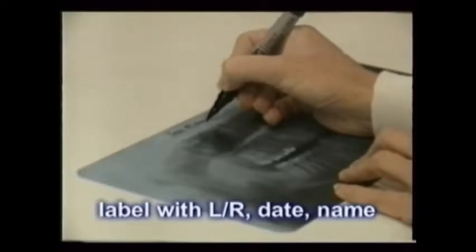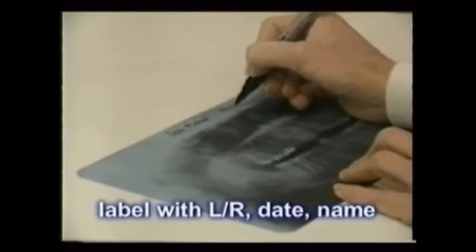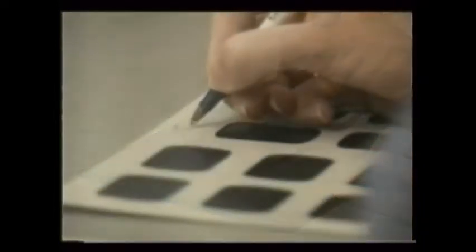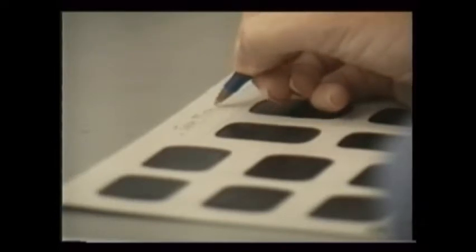Panoral films must have the left and the right sides properly marked, which is often done automatically by the X-ray machine. Plus the date and the patient's name must also be attached. Small intraoral films are placed in mounts and then labeled in much the same way. There is an exception, though. The small intraoral films have no left and right orientations. Instead, a raised dot lets you know you're looking at the film from the proper side.